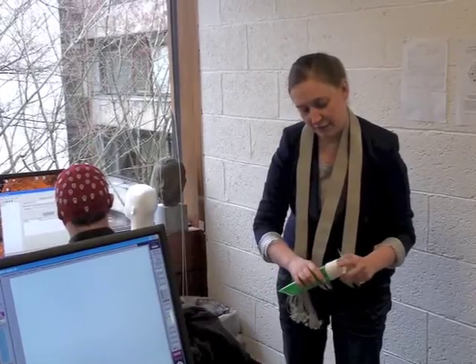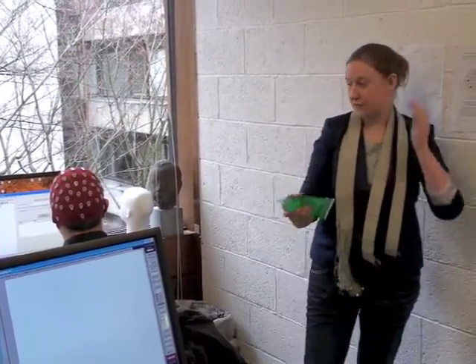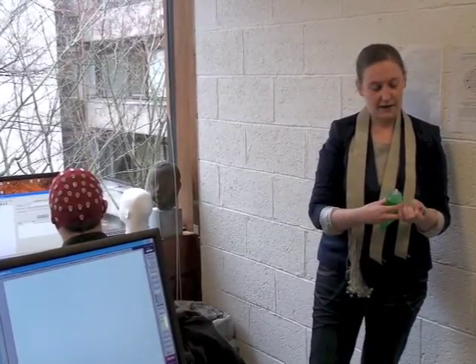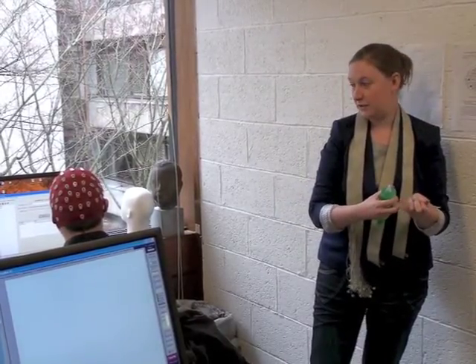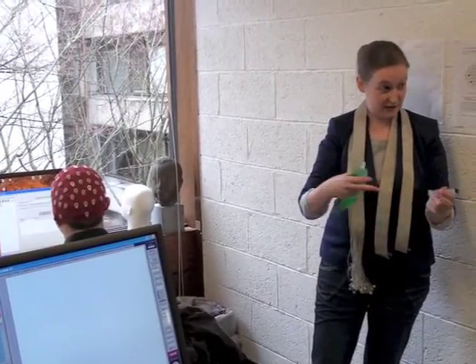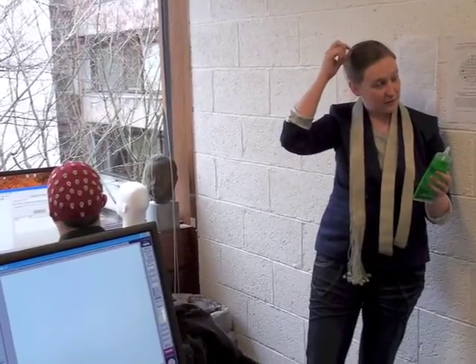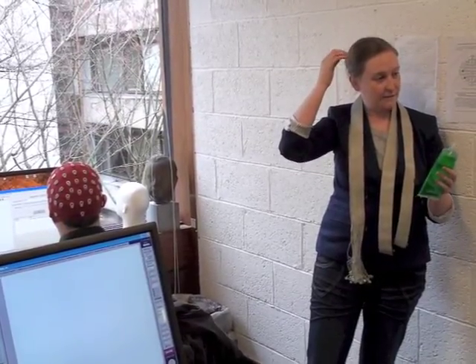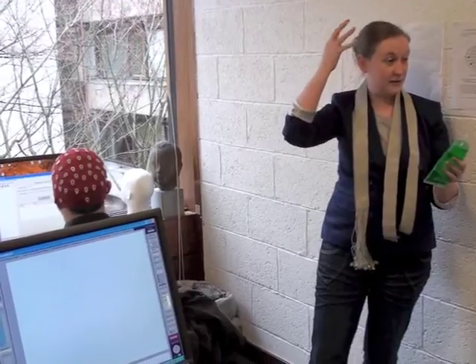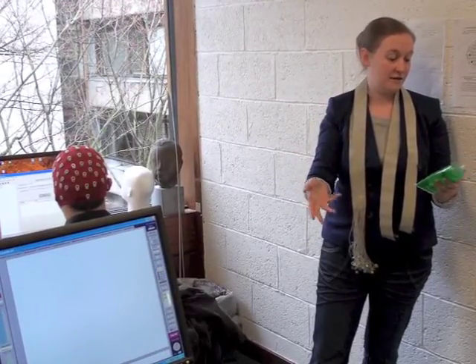This gel, before this type of system was invented, EEG was usually only used for medical purposes, because you'd have to shave someone's head, or part of their head, to get the electrodes onto their skin. But you'd also have to scratch the head so much with a little piece of metal before applying the electrode that it was quite painful and it would irritate the skin quite badly. Things have gotten a lot better.